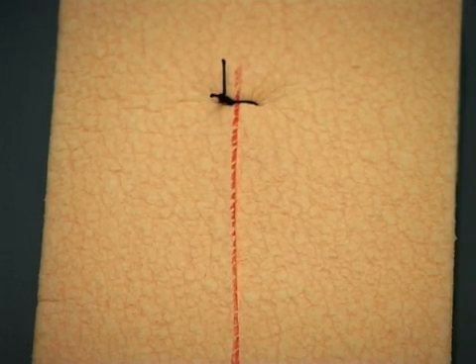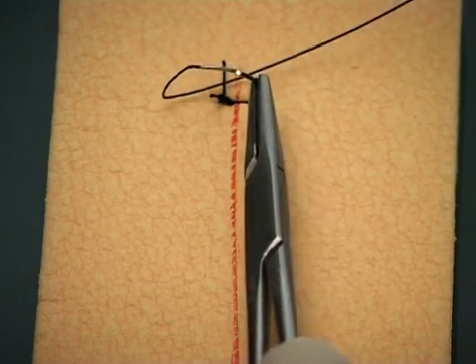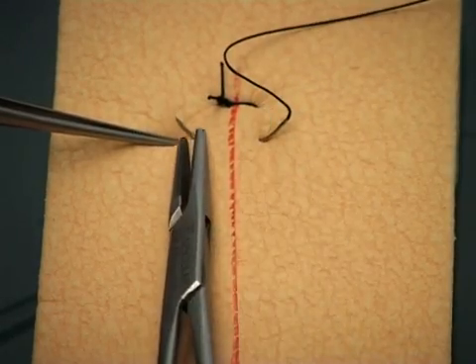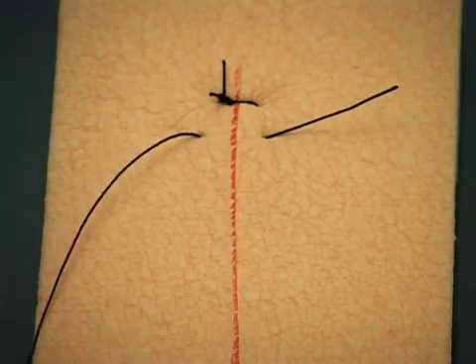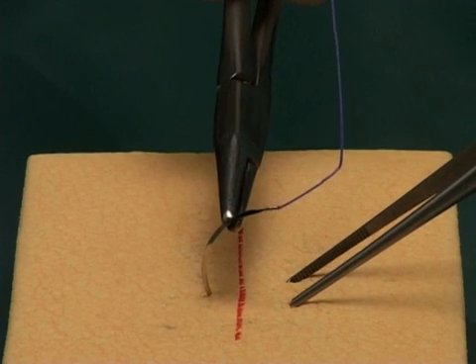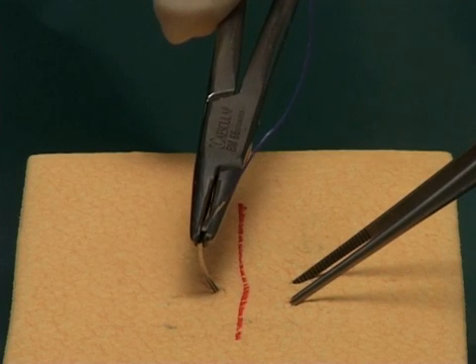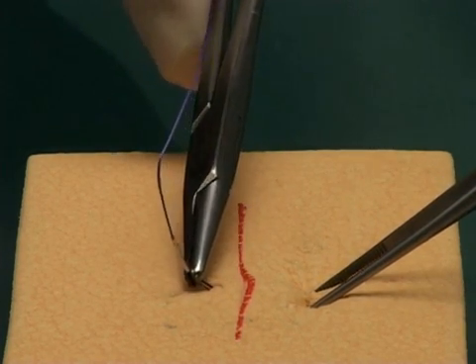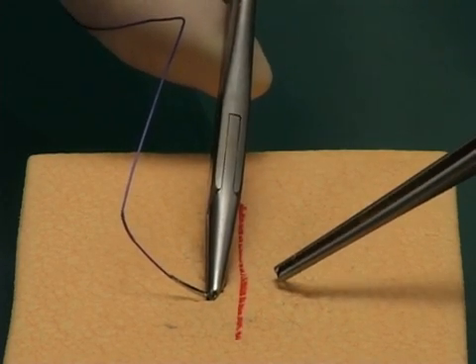Note the rotatory movement of the needle holder by a pronation to supination movement of the hand. Try to place your sutures evenly from each other and equidistant from the wound edge. Look again at the direction in which the needle enters the skin — entering at right angles helps to evert the wound edges. Observe how the needle is pulled out along the direction of its curve, which forms the arc of a circle.